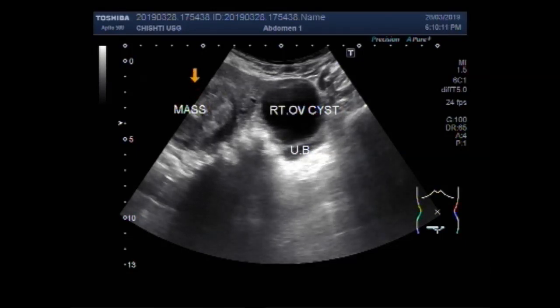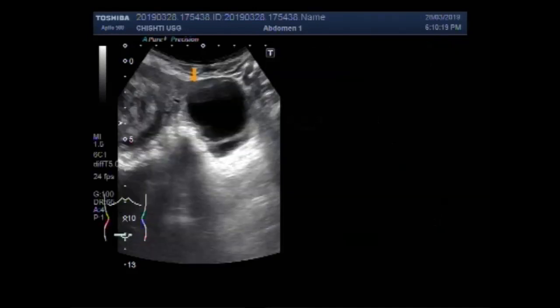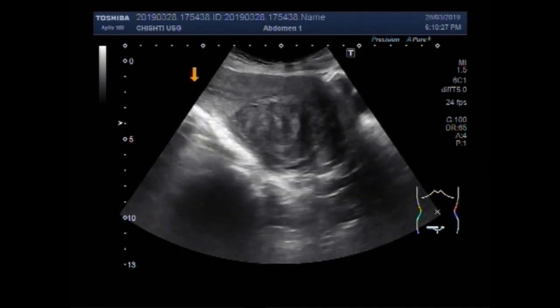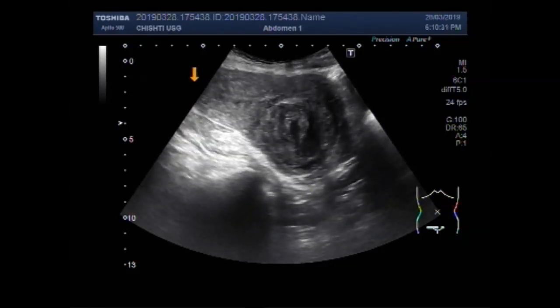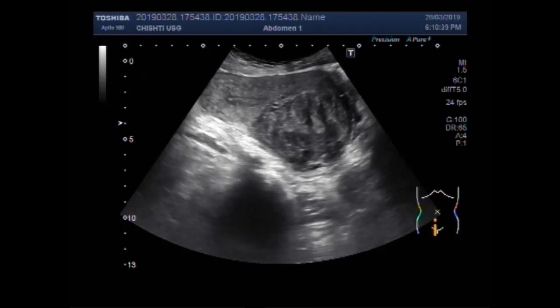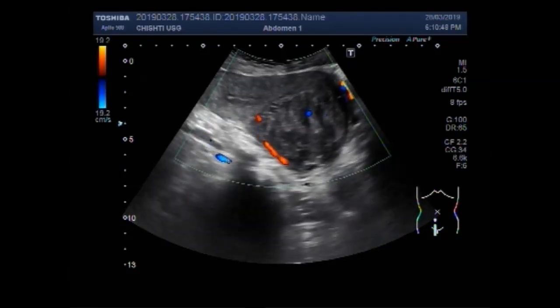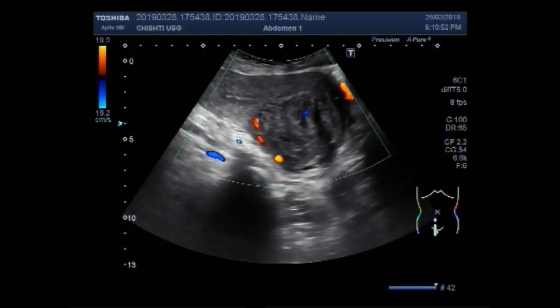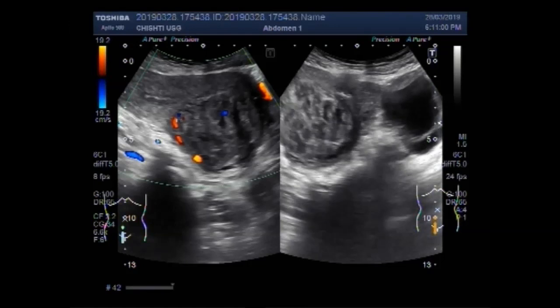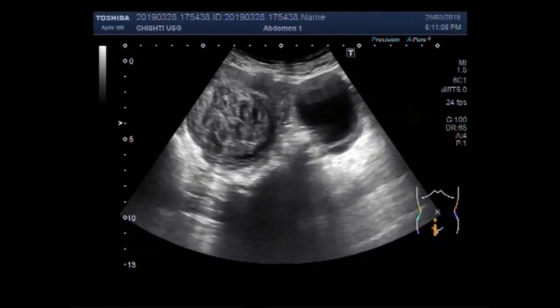This one is the uterine mass fibroid. You can see the mass lying in the proximal and middle portion of the uterus near the posterior wall. Now you can see the blood flow in the mass. Both the ovarian cyst and uterine mass are visible lying adjacent to each other.